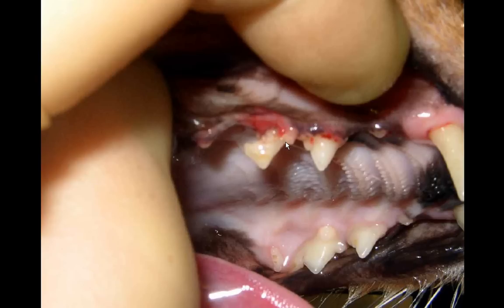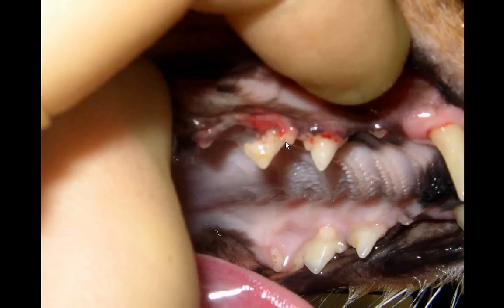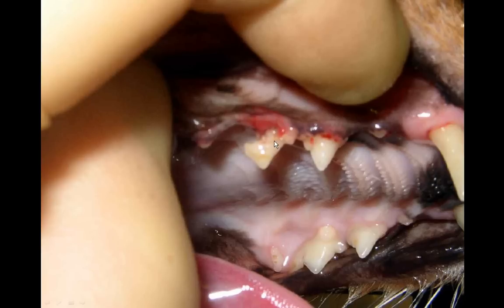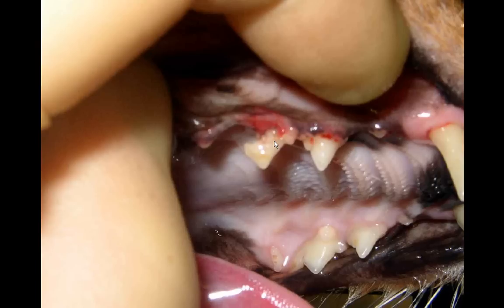Here's our friend, presents for his rabies shot. Is he in pain? No, he's doing fine. You look in his mouth — wow, he's got these. You just kind of touch this area with a Q-tip and yowza, he chatters and carries on. This poor fellow is definitely in pain.